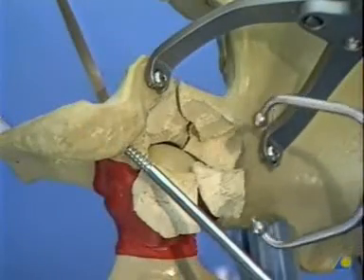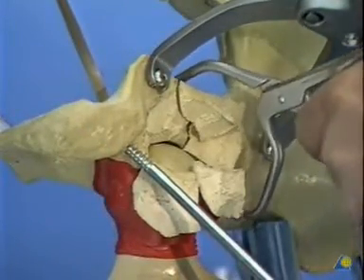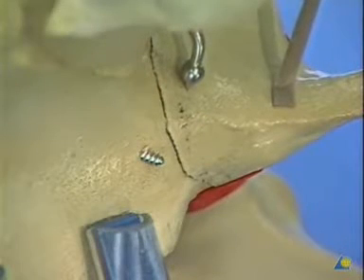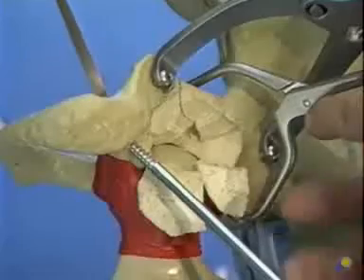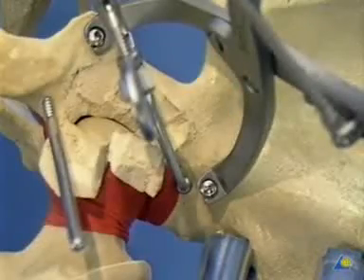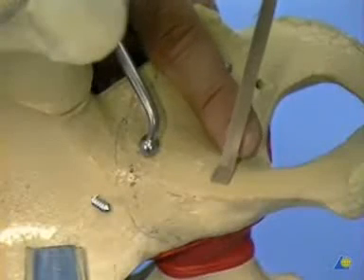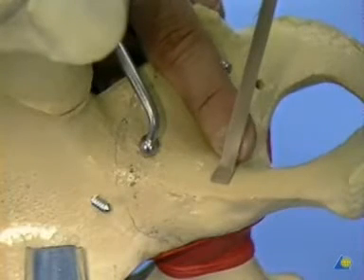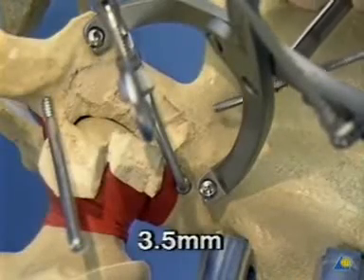This maneuver may not be adequate to hold the reduction, and additionally, the small angled jaw clamp with ball tips can be inserted through the greater sciatic notch with one tip on the quadrilateral surface of the ischiopubic fragment near the pelvic brim. Palpation of the obturator canal through the greater sciatic notch is an aid in directing a lag screw across the transverse fracture towards the anterior column.